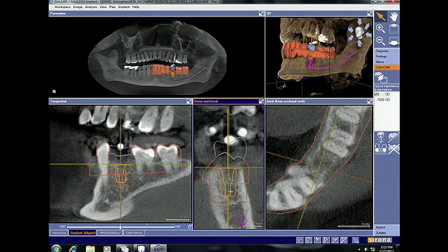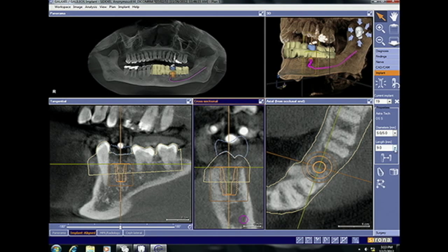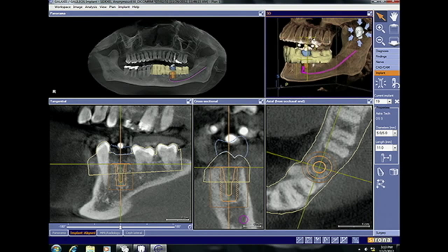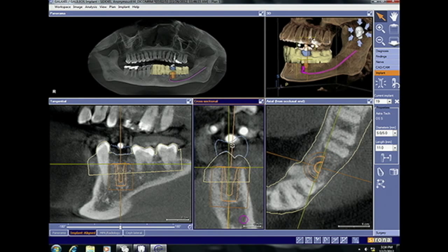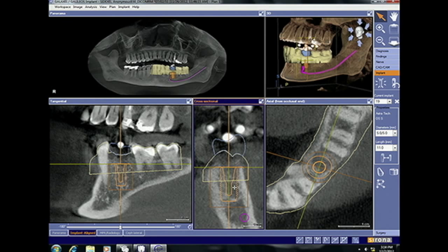I can move and translate the body of the implant and rotate it as needed based on the restorative vision I've outlined for this patient. You can see this implant is placed flush with the crest of the bone, and we have a good amount of distance from the inferior alveolar nerve. So I'd like to lengthen this implant. Clicking on the implant tab gives us a drop-down menu to look at appropriate lengths available in this implant system. I'm going to go with a 5 by 11 implant. Let's assume this is the ideal location — from a mesiodistal standpoint and a buccalingual standpoint — with the long axis through the central groove or slightly towards the buccal, which is most appropriate functionally to direct the long axis down the long axis of the implant itself.